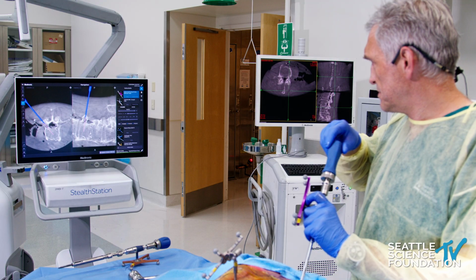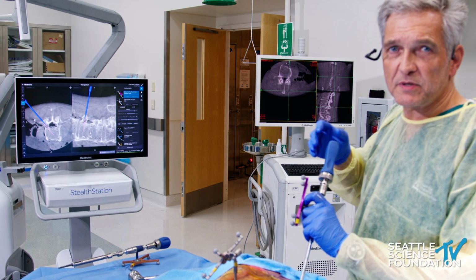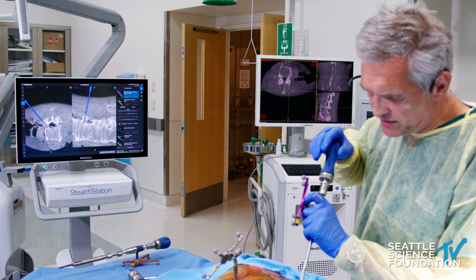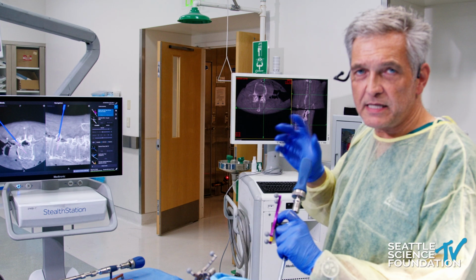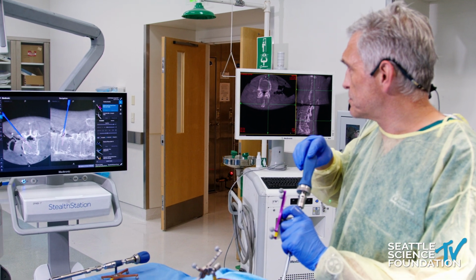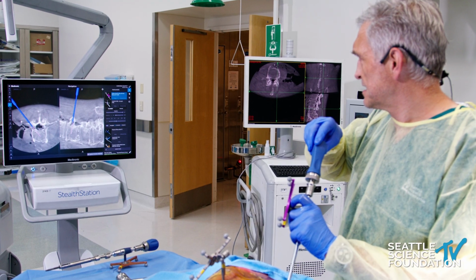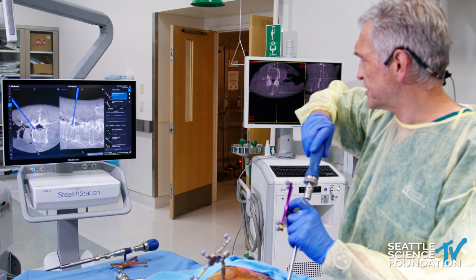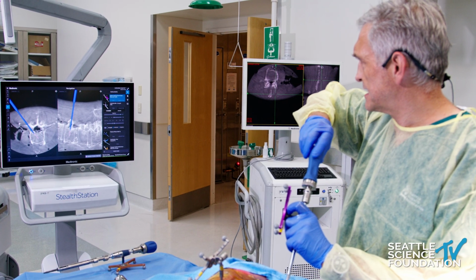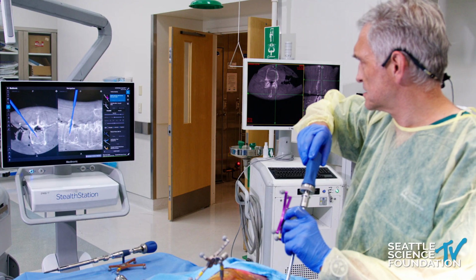I realign the trajectory of the awl here with the trajectory that I created with the burr. And now we're in cancellous bone, so you don't have to push a lot. And that's the other thing with navigation. Don't push, don't lean on the spine. I don't like malleting things. Everything should go really with minimal effort and with minimal pressure and pushing. So now we're basically going into the pedicle. It works out very nicely here. We'll go past the pedicle a little bit.